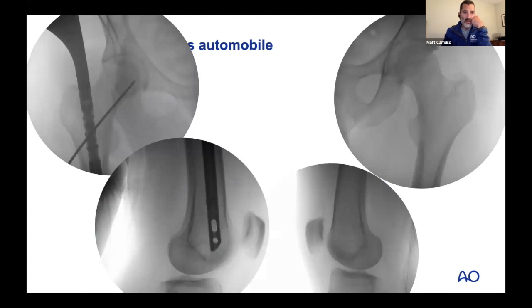So here we are, and we're about to lock the femur, and we call this the lesser trochanteric profile method of assuring the proper rotation. And so if I was fancy like Mitch, I would turn that image on the right-hand side and flip it over.